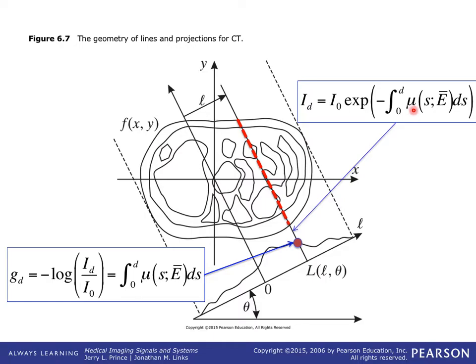As this number gets bigger, you get more and more absorption, right? And so it's the integration of that absorption, and then a number of photons get emitted and detected, and that's this number. So it's proportional to the number that came in times an attenuation factor. The attenuation is proportional to the depth of the patient, just how far it goes, and also to the amount of attenuation of the material as you're going through there.